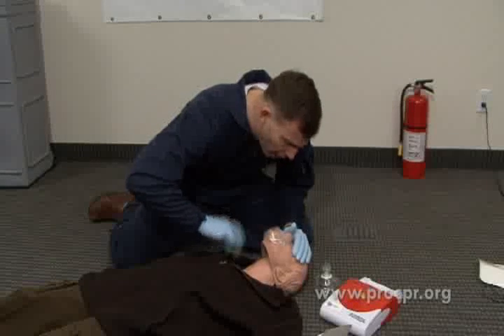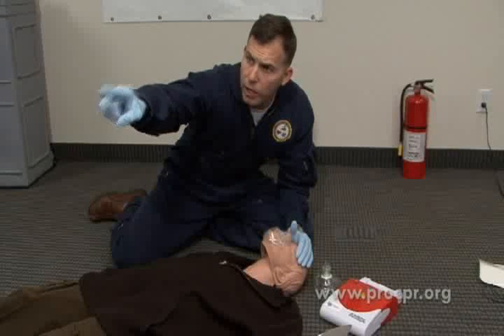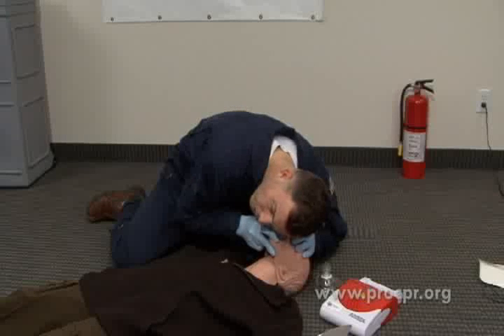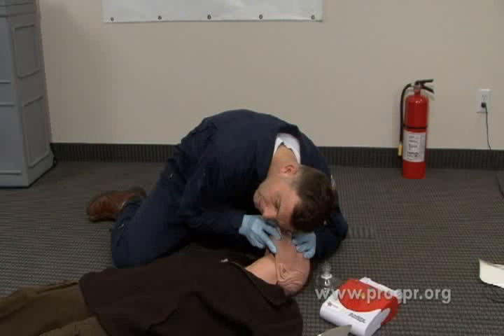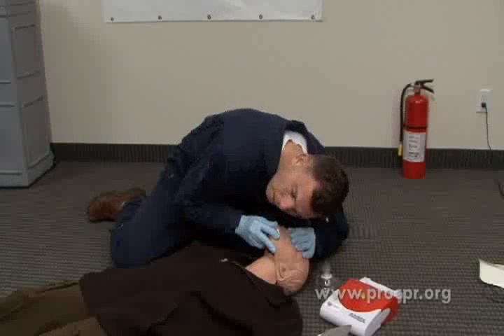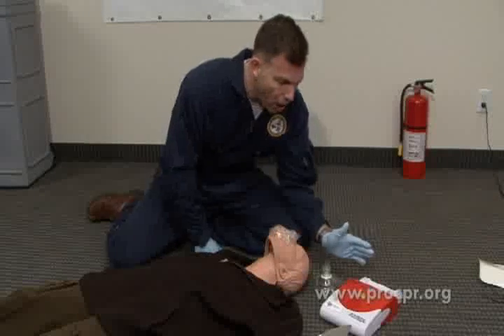Patient, are you okay? There's no response. You in the green shirt, go call 911 and come right back, or call the code. Look, listen, and feel for breathing with a head tilt, chin lift. There's no breathing. I'm going to give 2 breaths. The breaths went in, we saw chest rise and fall.